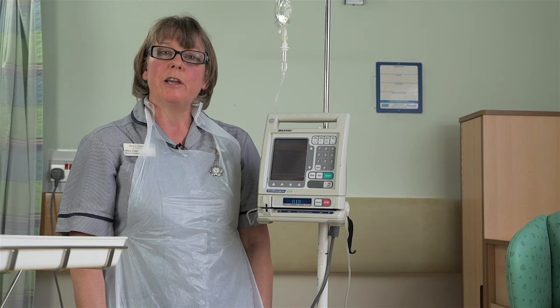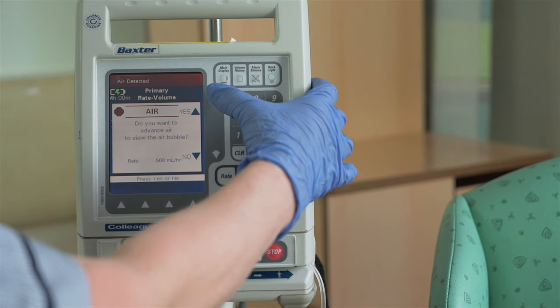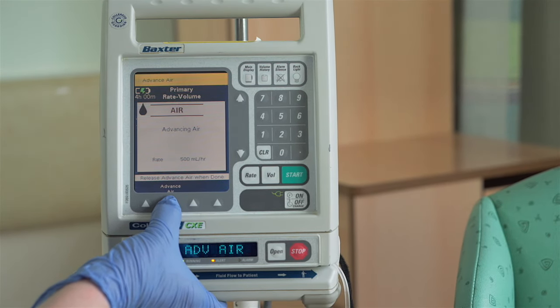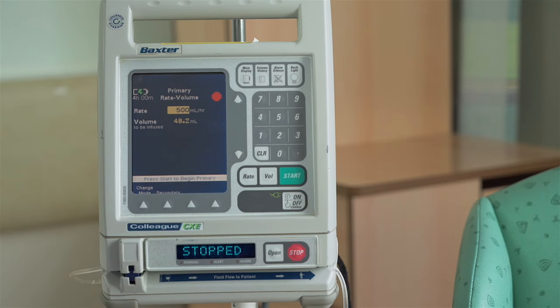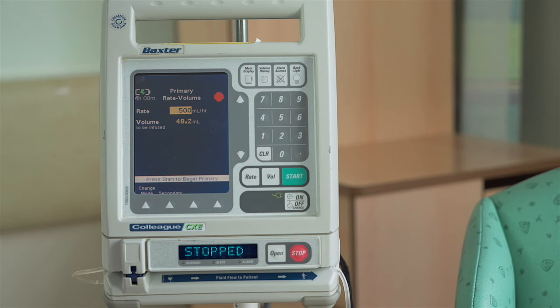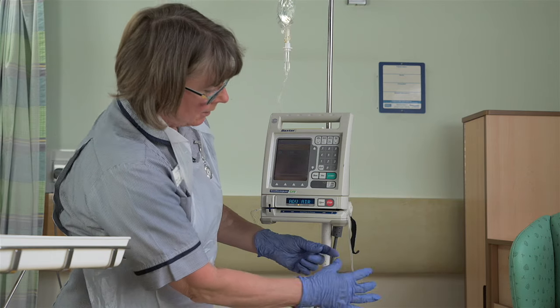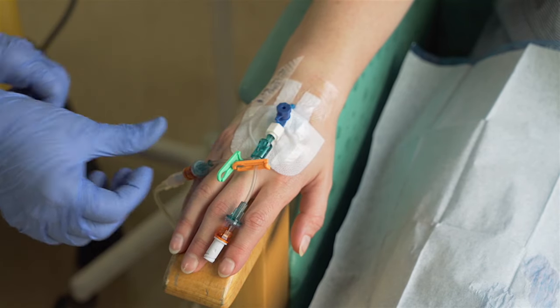This is to demonstrate removing air from the line without removing the giving set from the patient. The alarm will be running. It is asking if you want to advance air. Press yes and then advance the air. This will visualise the air in the tubing, but it will only bring it outside of the pump. Once you can see the air, clamp the tubing.